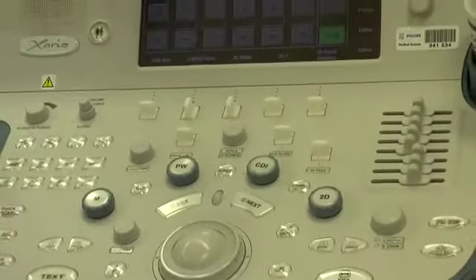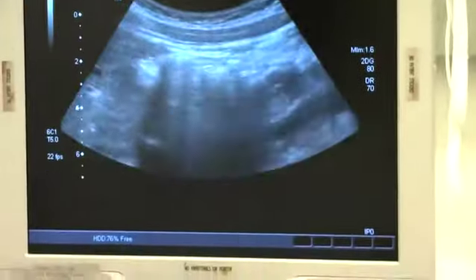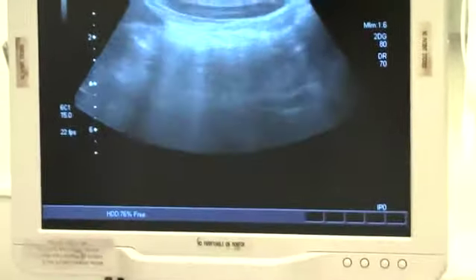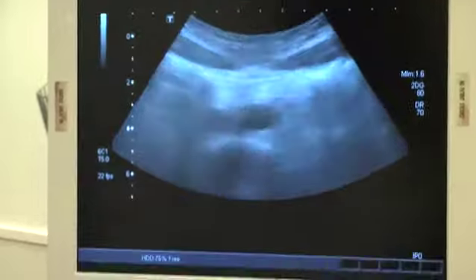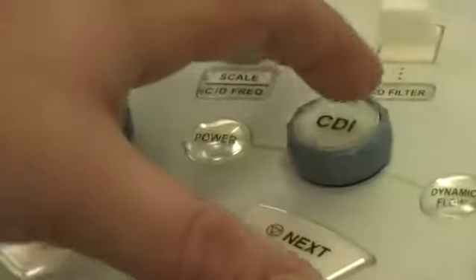So back to the gallbladder, we kind of got off kilter there. Oh, do you want me to show them power Doppler? Yeah, sure. Okay. That was the aorta, by the way. Alright, so back to the aorta. I'm going to show you guys another Doppler technique. Remember, color Doppler gives us information on flow and directionality.